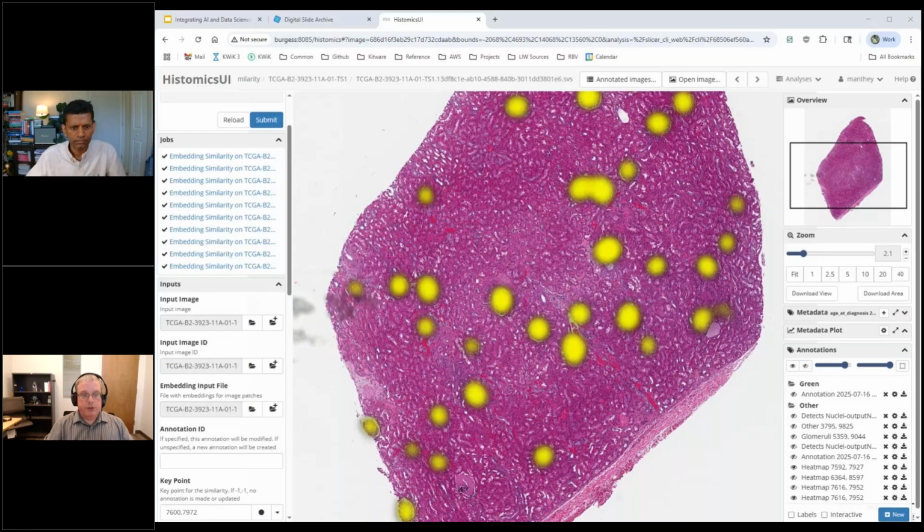Definitely. So one of the entire virtues of this Slicer CLI execution model is that you basically have something where we can have any amount of integration you need. So it can be just a simple interface where if you can run this as a command line program, you can package it up so it can be used in this manner, but you can also use it outside of this. So in this case, I'm using Docker, but again, we could have used Apptainer or Podman or one of these others. And with that same package, I could have typed, hey, I'd like to run this on my command line. So when I'm running the embedding to first do the calculation, I could run it through this interface, or I can type it on the command line and run it there, or script it in any way I want.